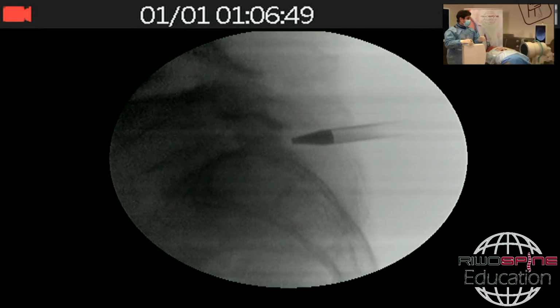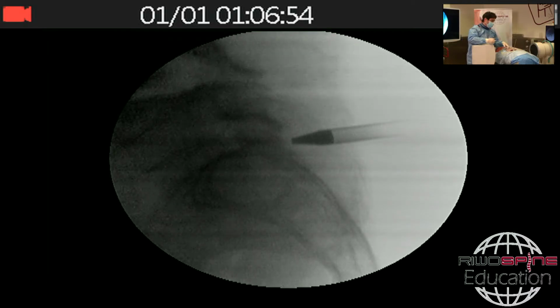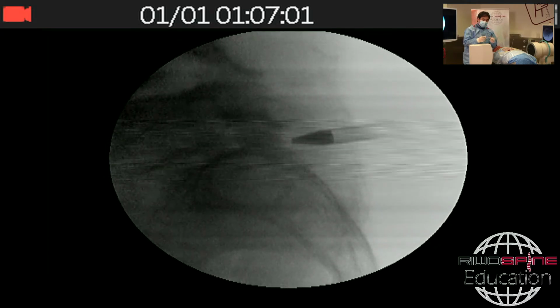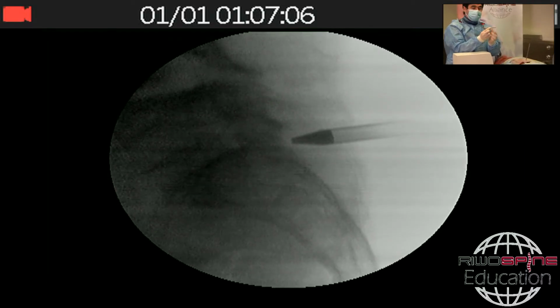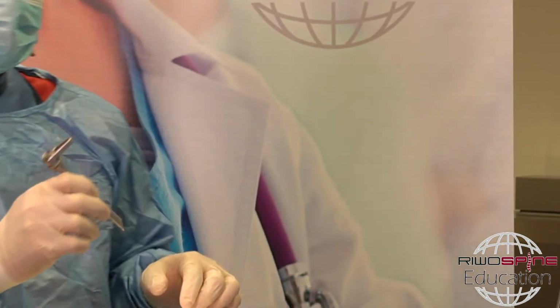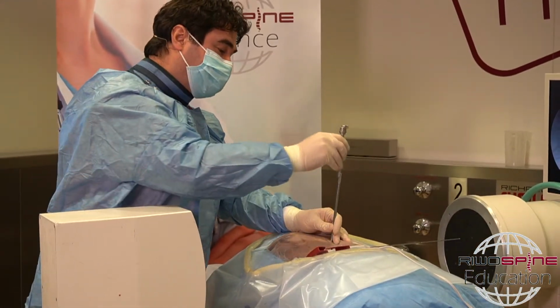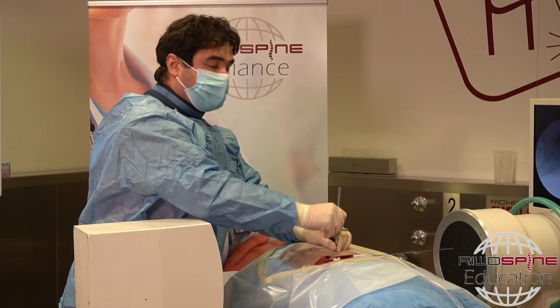Okay. Then I see that my dilator is outside of the spinal canal, then I can continue the procedure. Next step after the dilation is introducing the sleeve. We use the 30-degree bevel sleeve, and the handle we attach like that. This way, I know the opening of the sleeve according to the handle position, and I introduce it towards the flavum ligament, meaning the medial aspect. Okay, the approach is done.